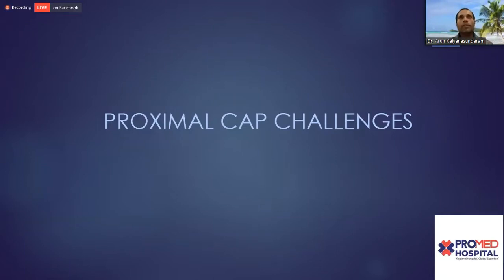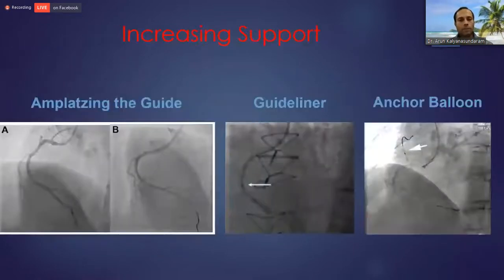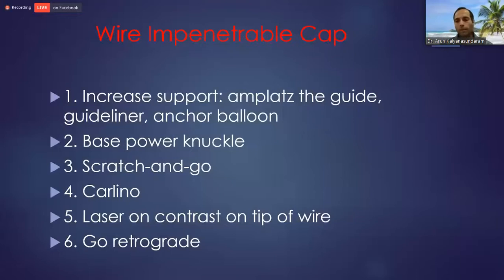So the way I've structured this whole talk is to come up with some scenarios and give some solutions, but also occasionally throw in some cases. So proximal cap challenges, one of the first, the bottom line is you got to have good backup. CTO, PCI, and proximal cap, it's all about backup.